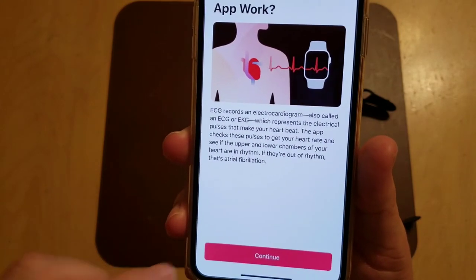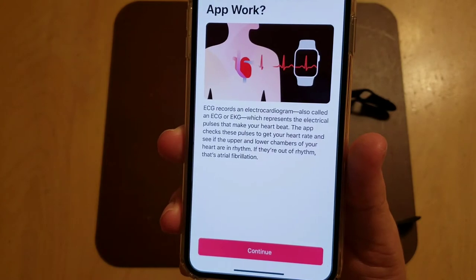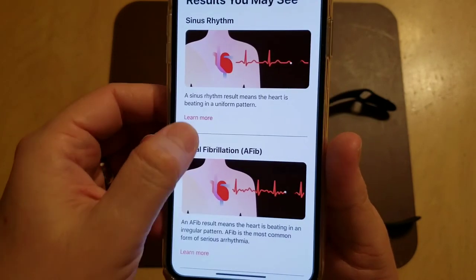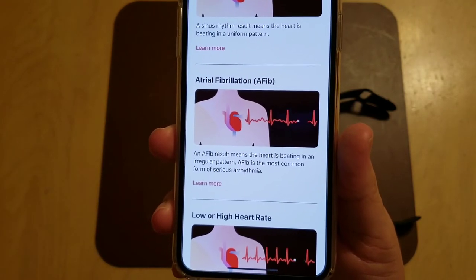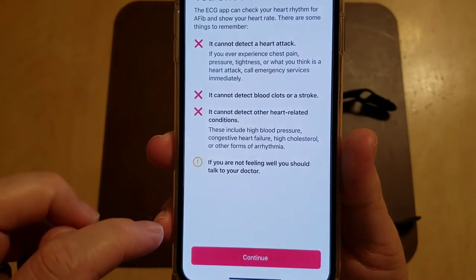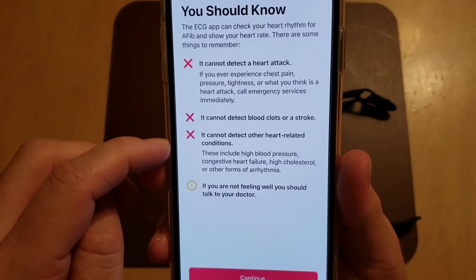If they're out of rhythm, that's atrial fibrillation, which is apparently the most common or easily detectable arrhythmia. There's normal sinus rhythm, meaning the heart is beating in a uniform pattern. AFib means the heart is beating in an irregular pattern — it's the most common form of serious arrhythmia. There's also low/high heart rate and inconclusive results. Importantly, it cannot detect a heart attack, blood clots, stroke, or other heart-related conditions.